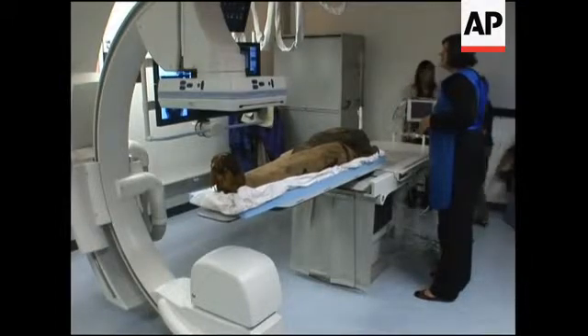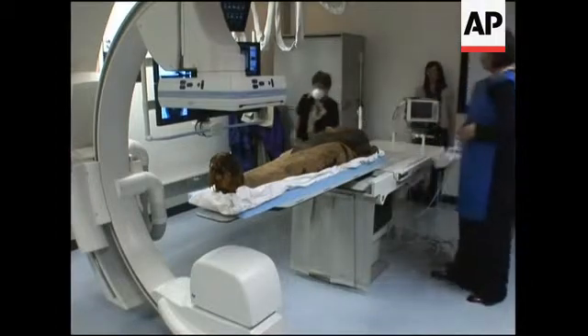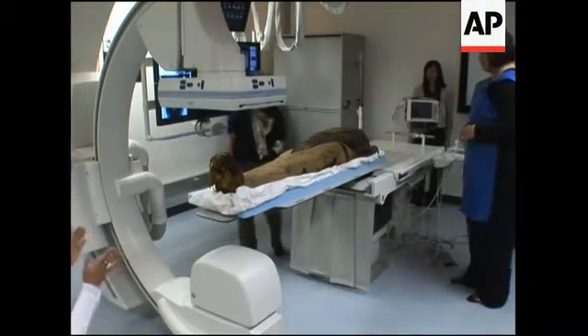We'll just put it at 96 and then hold it on. The interesting thing is that the feet are definitely offset.